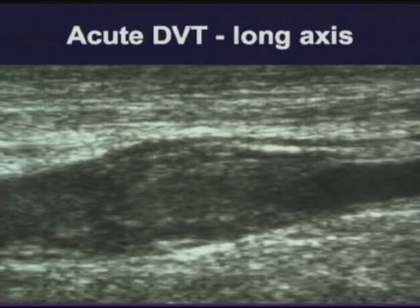It is said that fresh thrombus tends to be anechoic and older thrombus tends to be echogenic, and while that's true as a usual rule, most thrombi which are acute with modern equipment tend to be somewhat echogenic and somewhat heterogeneous. And so echogenicity per se is not a criterion for separating acute deep venous thrombosis from scarring.